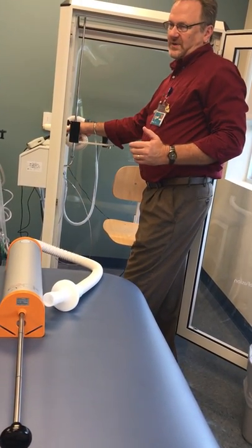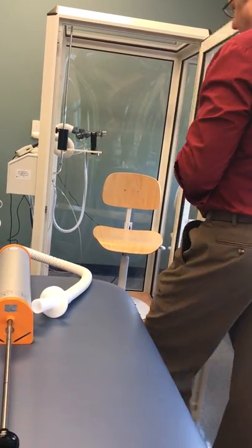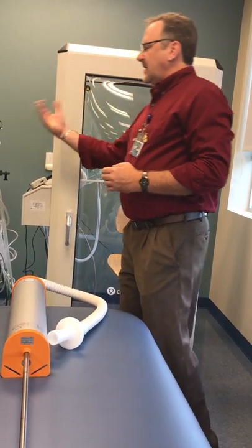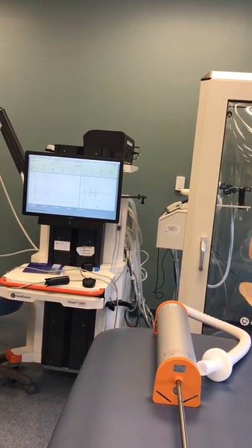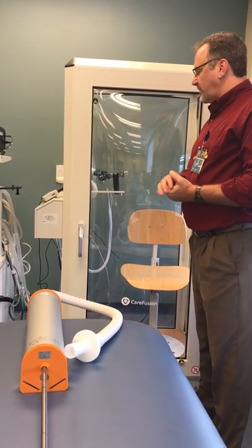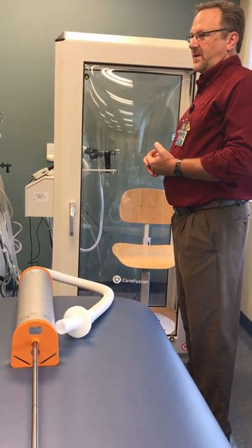We have this set up like we're going to do a test so you can see the setup. Then you close the box, lock it, and run the test just like it was shown on the other video for the computer controls for the plethysmography calibration. That is how you set up for a calibration and also how to set up the transmural tube for the body box plethysmography.